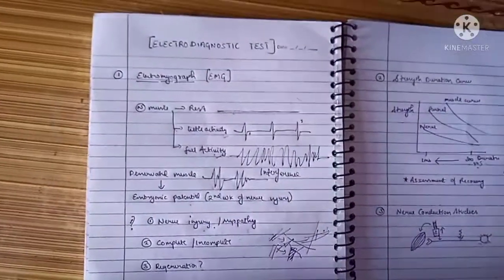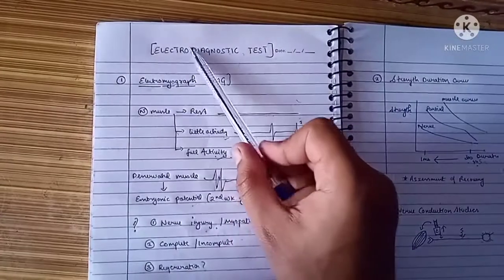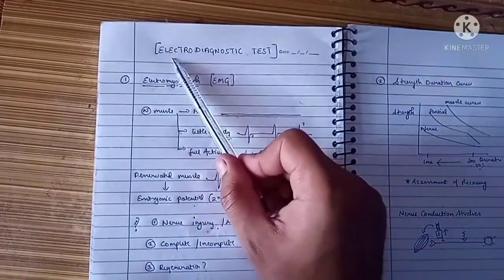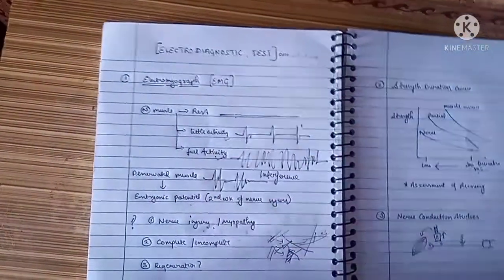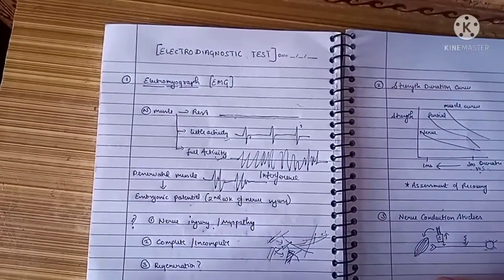Hello everyone. So in this video we are going to talk about electrodiagnostic tests. As the name suggests, these are diagnostic tests which use electrical activity to help us in diagnosing certain neuromuscular conditions.